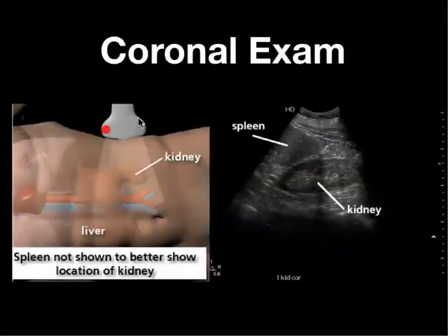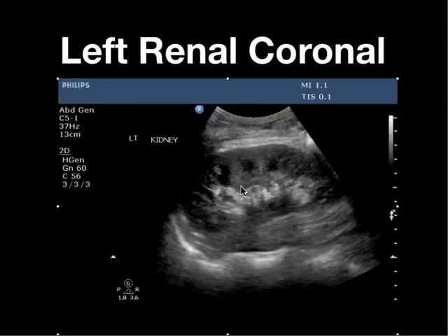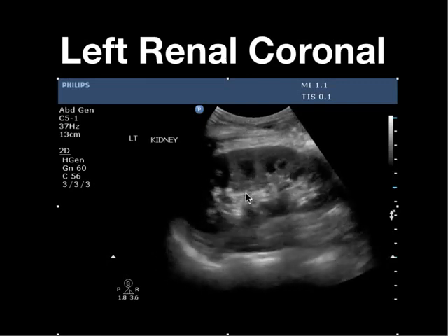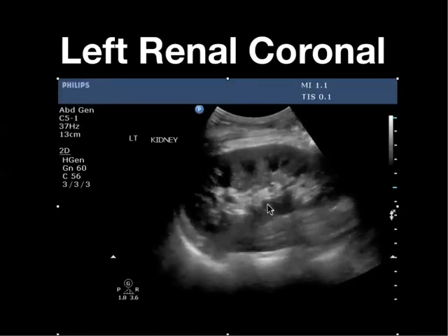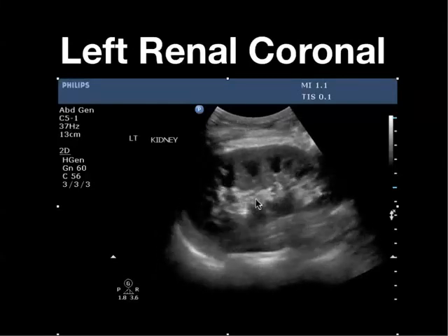Here's the left kidney in the coronal plane — indicator up towards the head, shooting lateral to medial. You can do this with the patient supine or in the right lateral decubitus position. You can see the inferior tip of the spleen, the kidney, the surrounding renal parenchyma, and the hyperechoic renal pelvis. Sweeping through into the area where the opening of the renal pelvis is gives the best visualization of hydronephrosis.